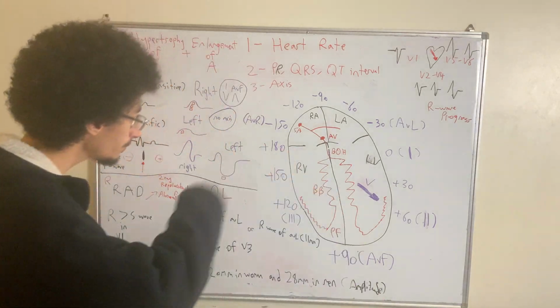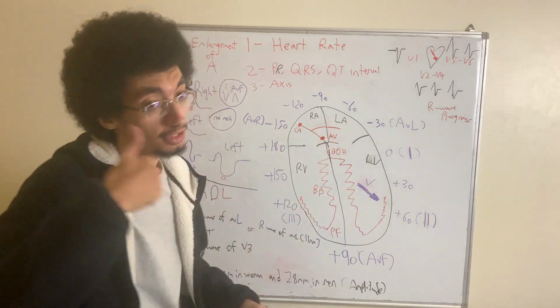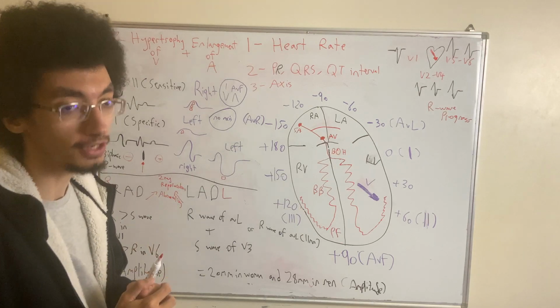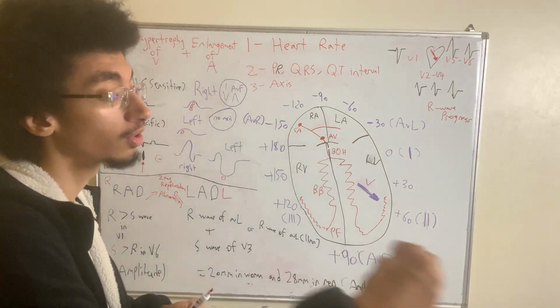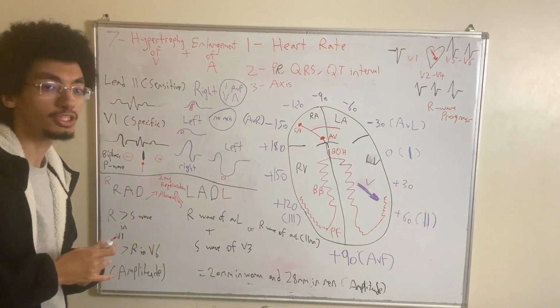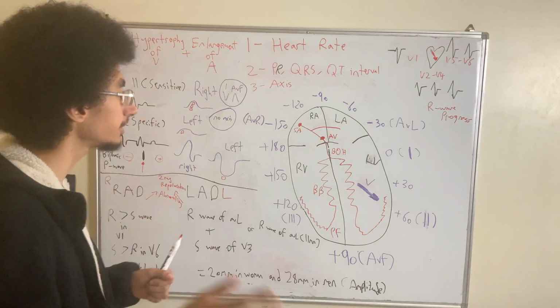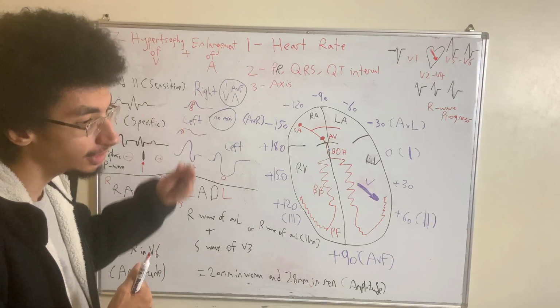However, if we now have left atrial enlargement, now the duration of the P wave will be affected, because it's going to be depolarized toward this area a lot more longer. So now the criteria, like we said, if you see the amplitude of P wave is affected, as well as right axis deviation, this is P pulmonale, right atrial enlargement.